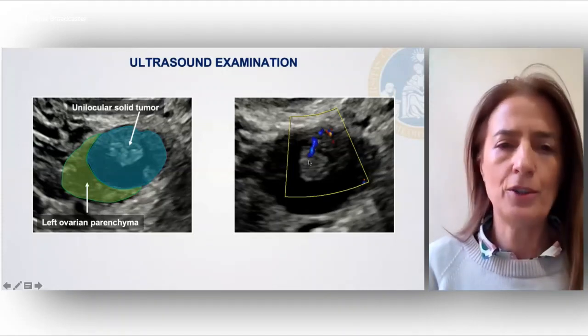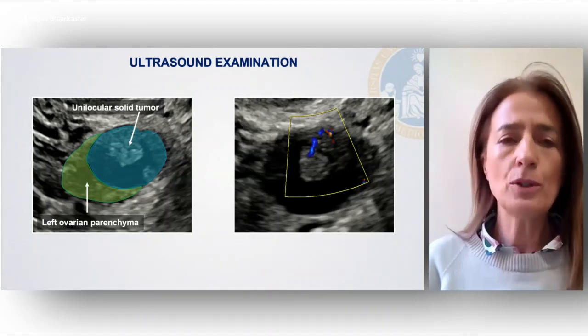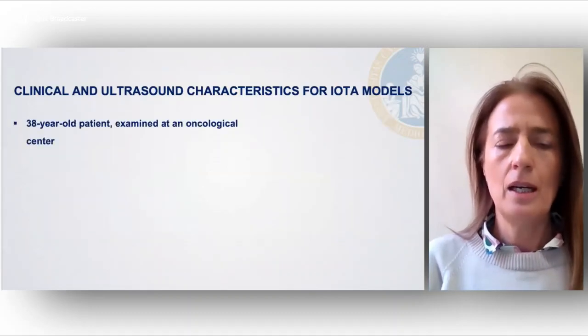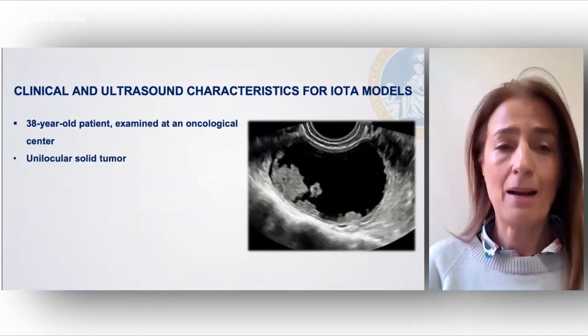This is the summary of the ovarian tumor. But if we are not so experienced and we want to use IOTA models, Francesca, we can try to use them. So we have to collect the most important parameters.